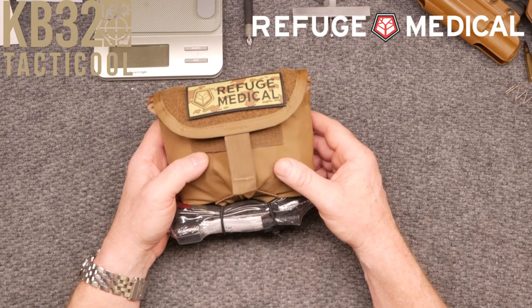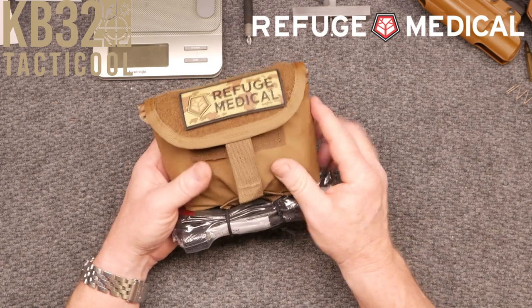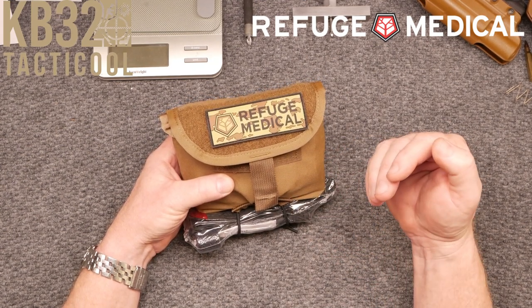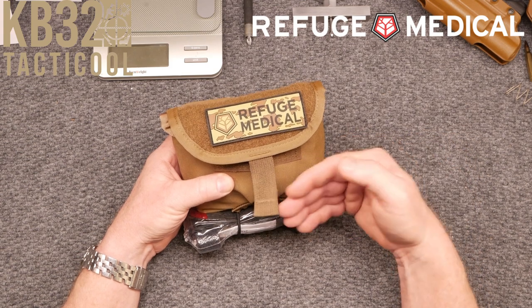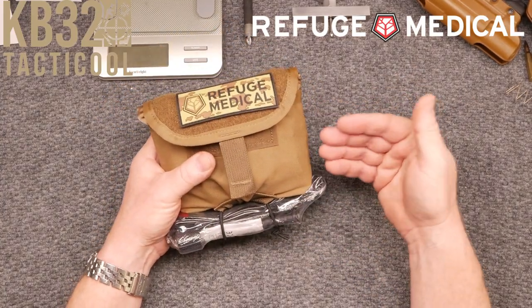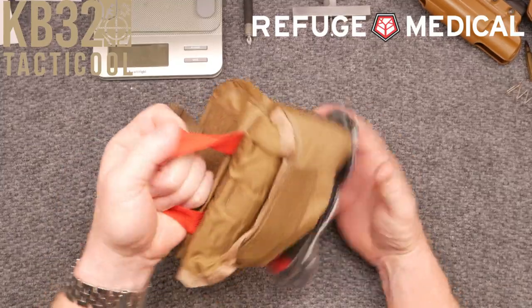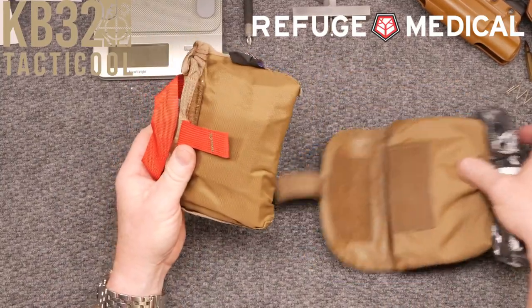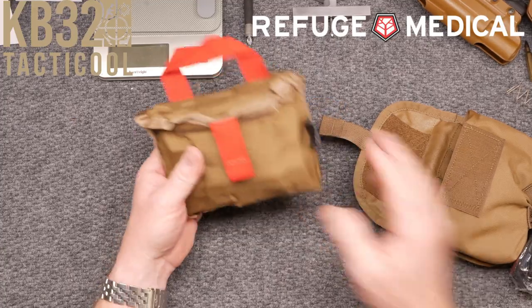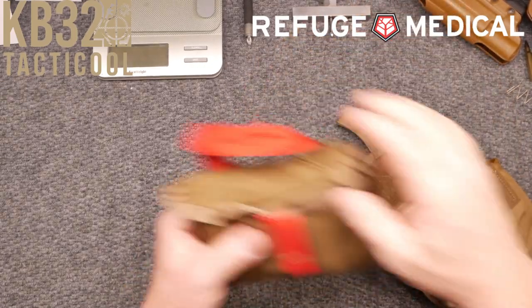Talking to Bear, one of the things is he set these things up in order of use. Using a quick deploy inner pouch, it contains premium components from Quick Clot, North American Rescue, Tag Med Solutions, and H&H Medical. It is designed to be reached by either hand — that's why you put it in the small of your back. All you've got to do is reach back there, pull the red tab, and then you have access.